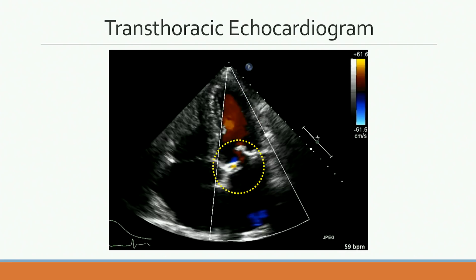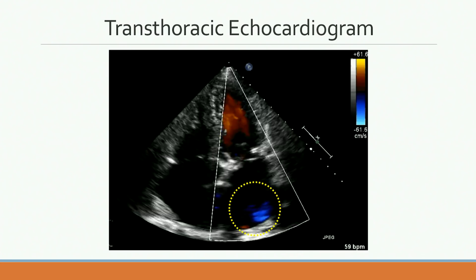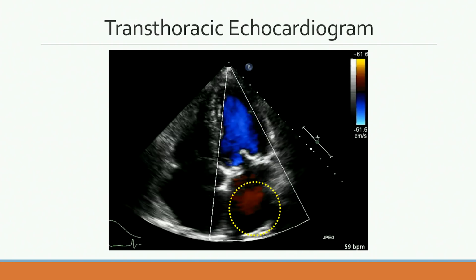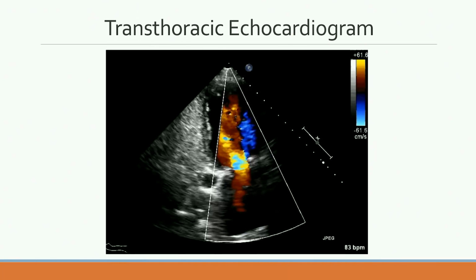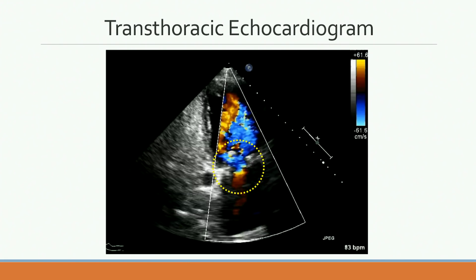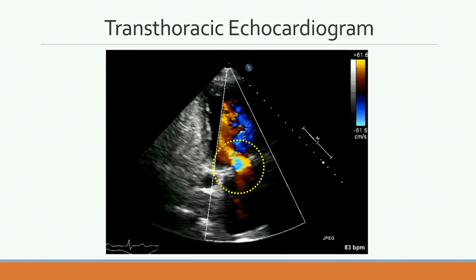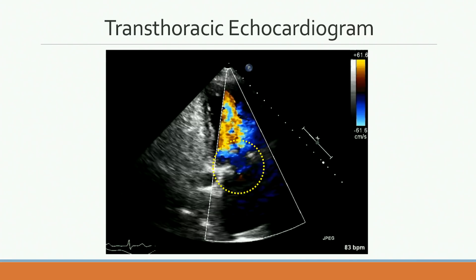However, if you do pay attention in the back of the left atrium, there are color signals that might signify that mitral regurgitation is more significant than not. We can look at also a two-chamber view. Again, color is on, bioprosthetic valve, and again, there is no color signal that would tell us there is a significant paravalvular or transvalvular mitral regurgitation.